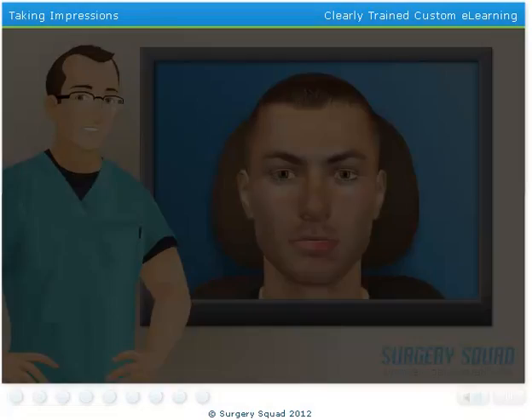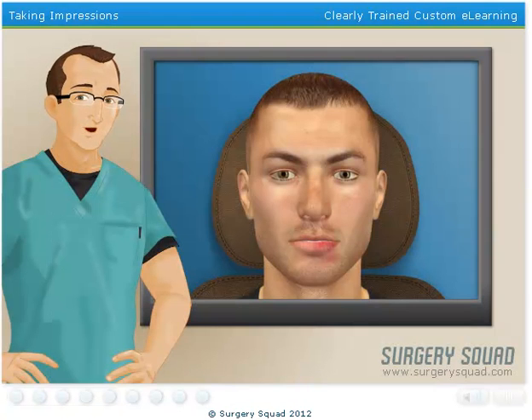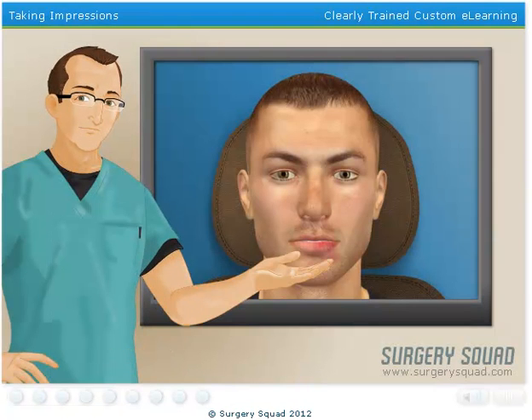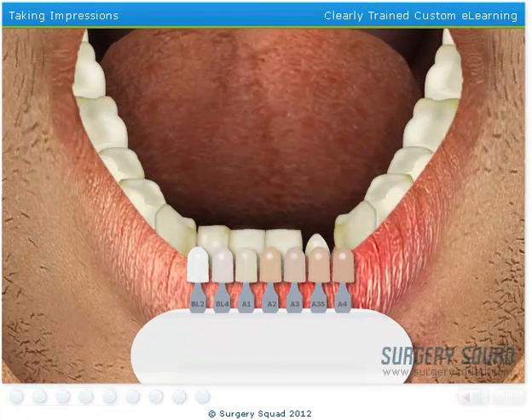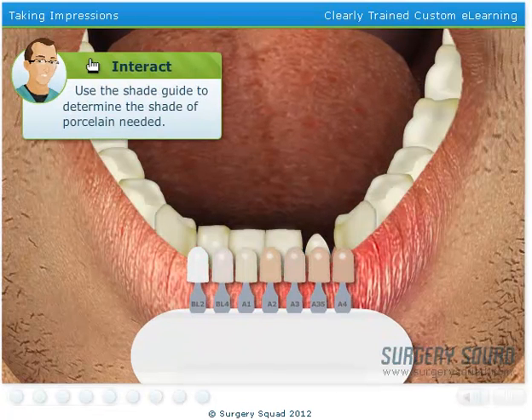Excellent work! My dental assistant just informed me that our patient would like an all-porcelain crown on the tooth. So before we can finish up with them for the day, we need to determine the shade of porcelain that resembles their natural teeth. Can you handle this? Are you color blind? That doesn't match at all — try a different shade.